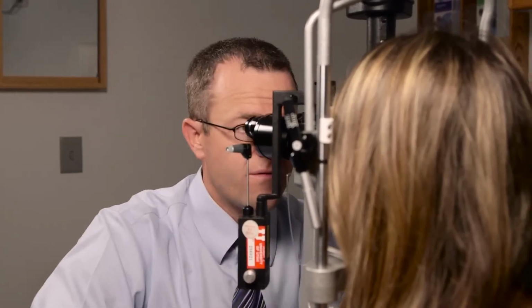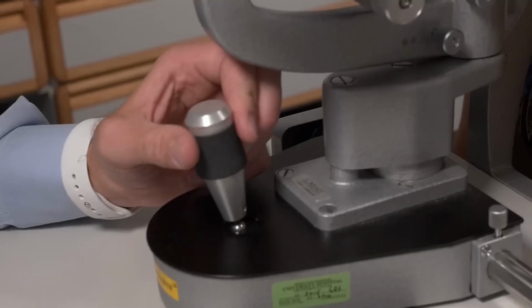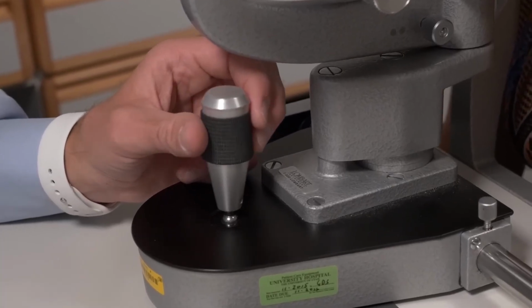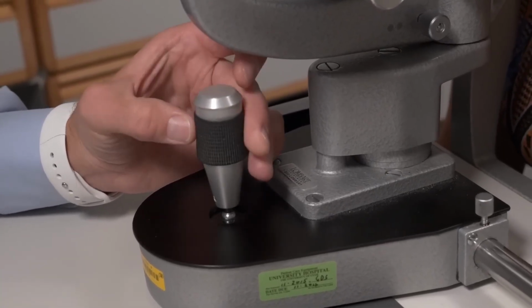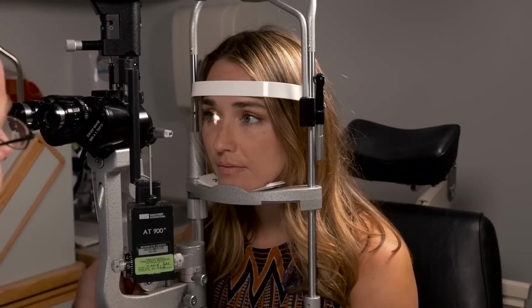All right, so first things first, you'll notice on the slit lamp, there's a joystick down below that can bring things into focus by moving it forward and back. And also you can move it left to right, and then you can spin it, and spinning it raises it up and down so you can get the eye in level.